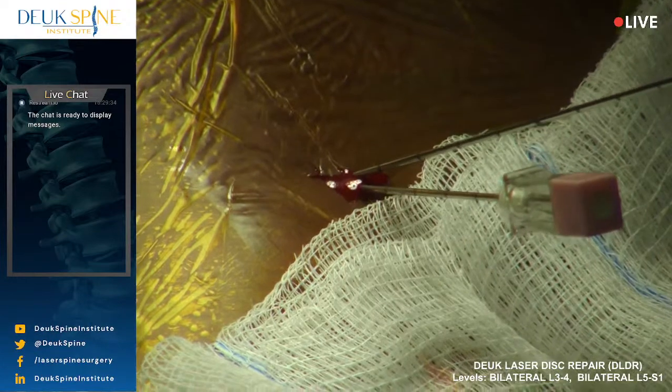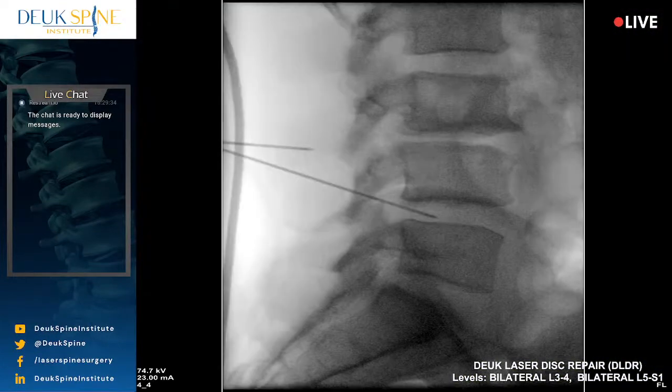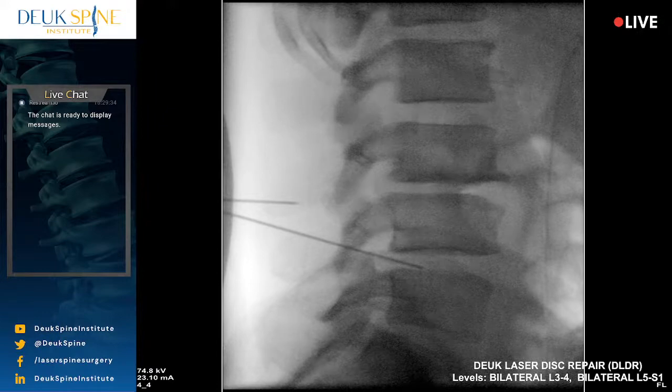But now we're going for 3-4. Can you show us 3-4? A little better. It looks like we got some orbit, maybe a degree of orbit we need to fix, and possibly some wag. Yeah, some wag. So the orbit's good, we just need to fix the wag now. Basically, we're using an x-ray machine to navigate. And to do that, we need to make sure the x-ray machine is quote-unquote calibrated. That's really good there, Jordan. That's perfect. Thank you for doing such a good job.